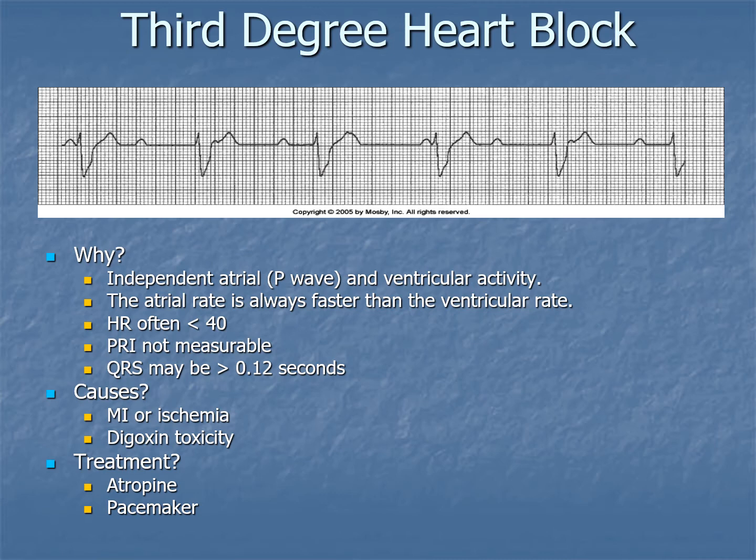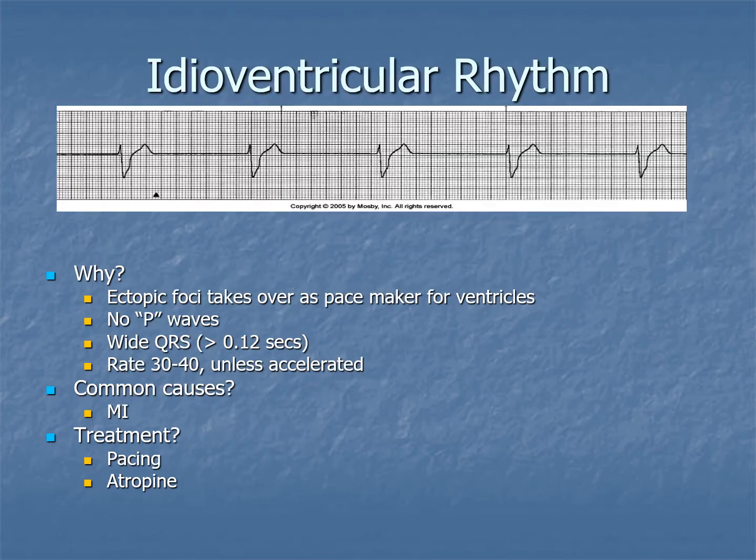degree type 2. This is a sick patient. They need to be intervened with. They need to be monitored very, very carefully, and they're potentially at risk for further deterioration from a cardiac perspective.